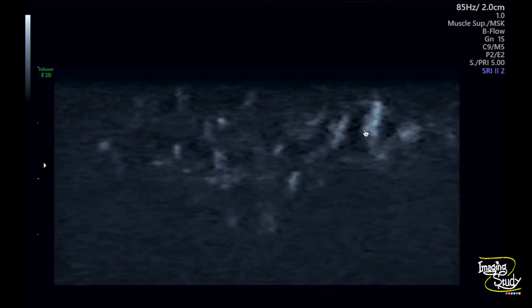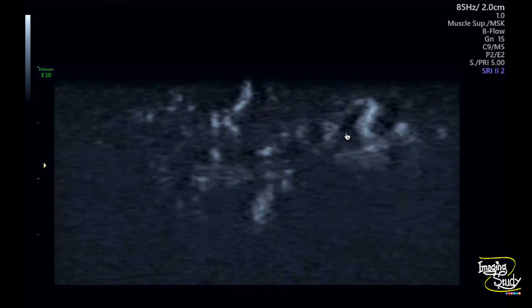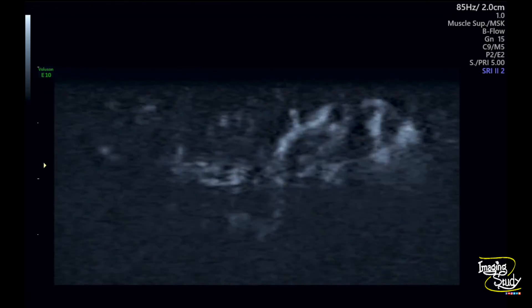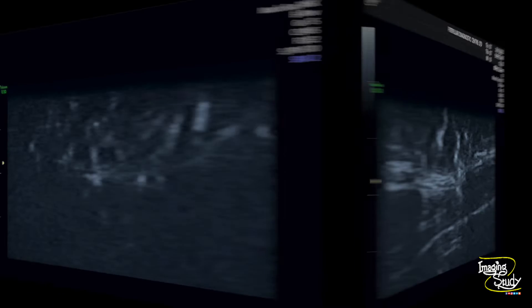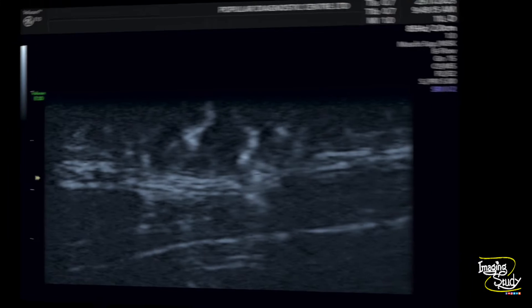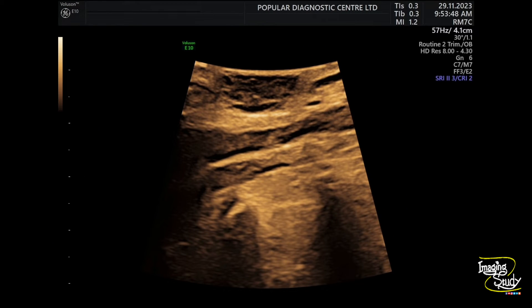The B-flow image shows prominent vascular channels within the lesion, and the still picture shows multiple vessels within it. We also used the curvilinear transducer to see deeper detail. You can see the lesion, the lung border, and ribs casting posterior acoustic shadows. There is no deeper extension of the lesion.